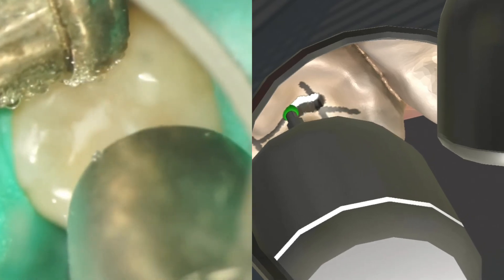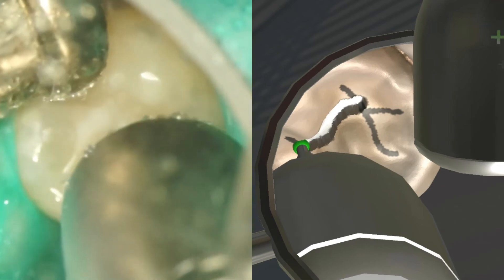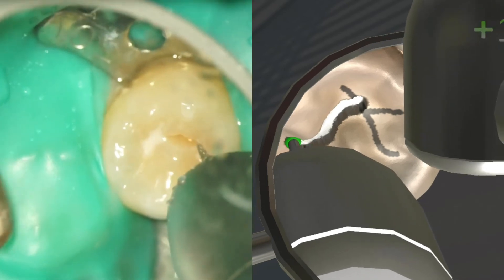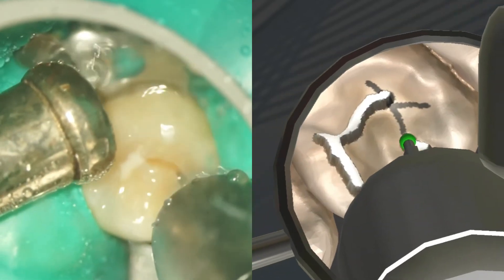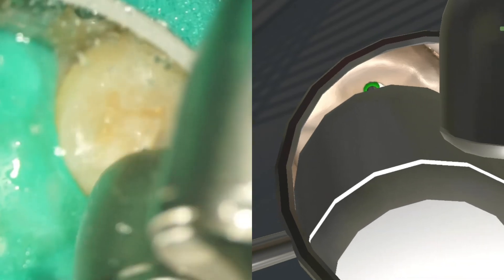Under indirect vision, the movement of the burr is continuously adjusted based on the previous movement. If a dull burr was used, this level of cutting efficiency could not be achieved and you cannot control the delicate movement, and there is a risk that the burr deviates from the set path and cuts unwanted enamel.